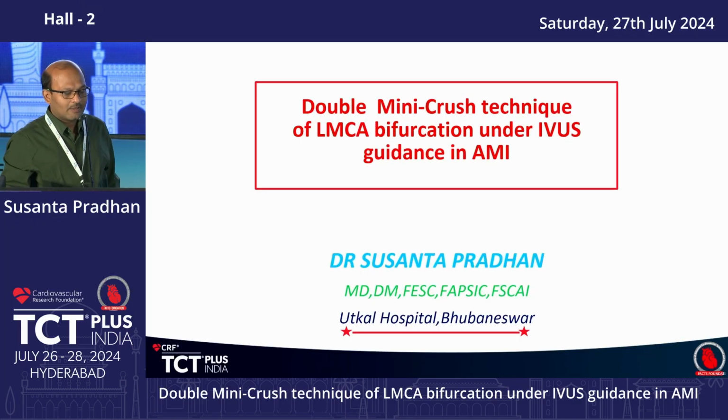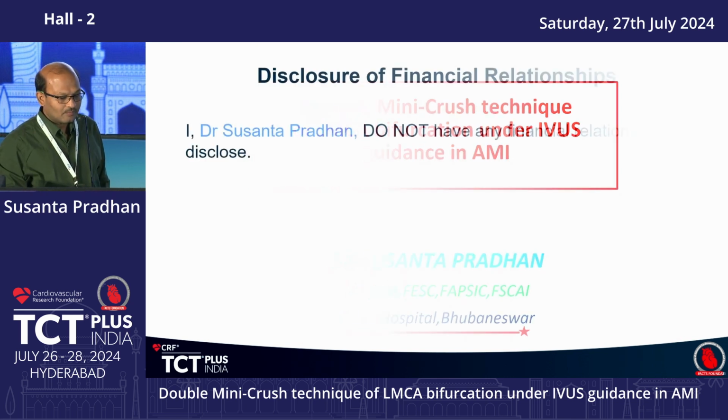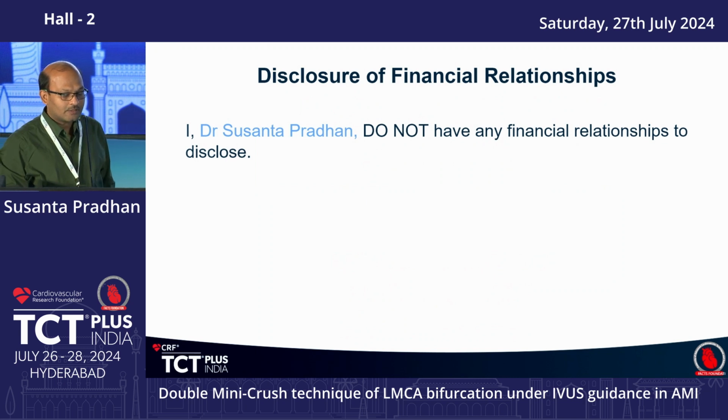Case having done with left main bifurcation in a patient of ST elevation myocardial infarction. There is no conflict of interest.